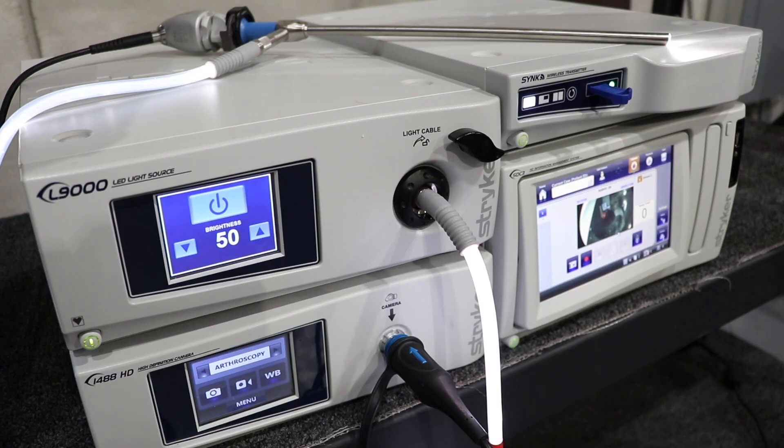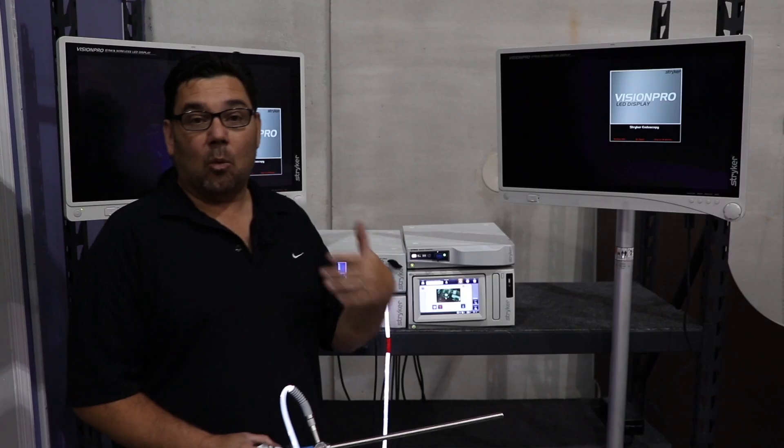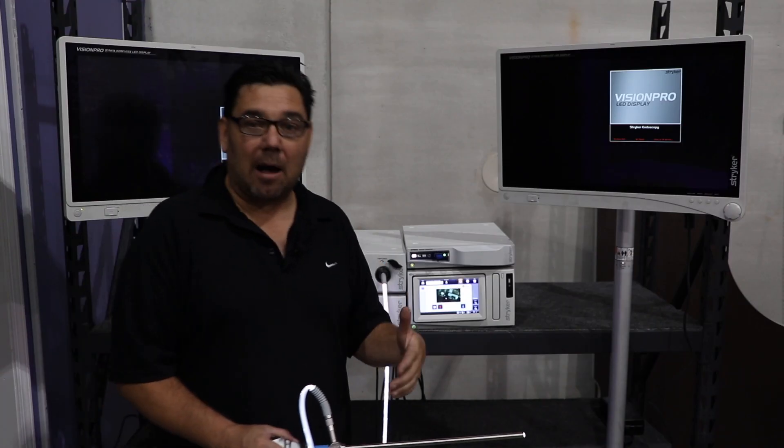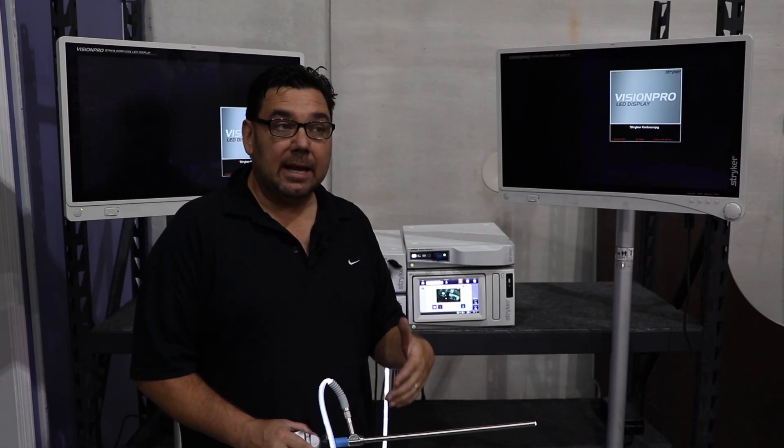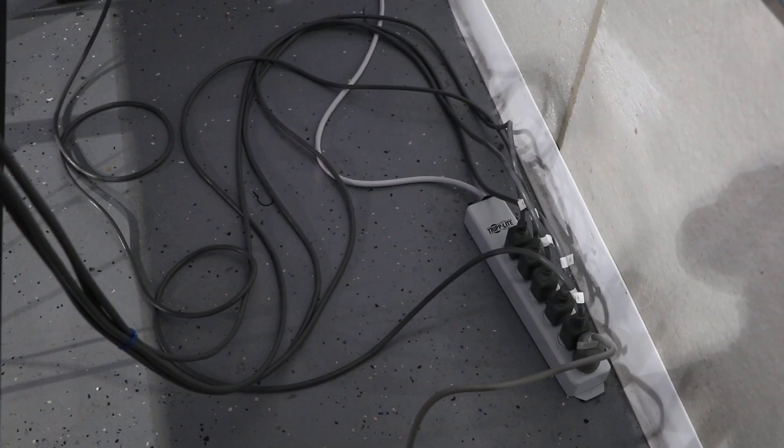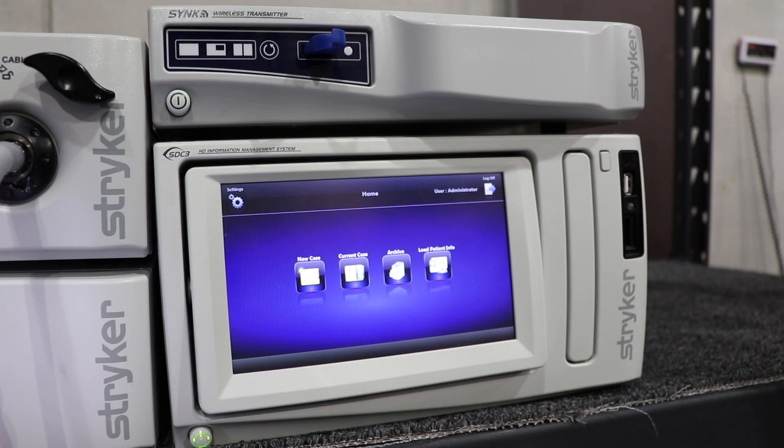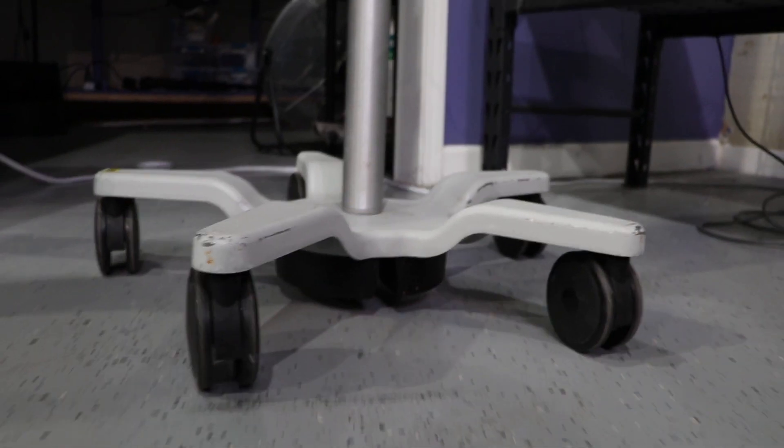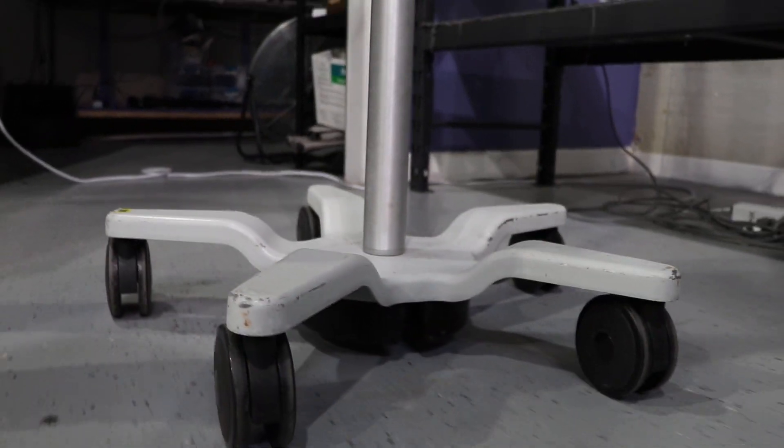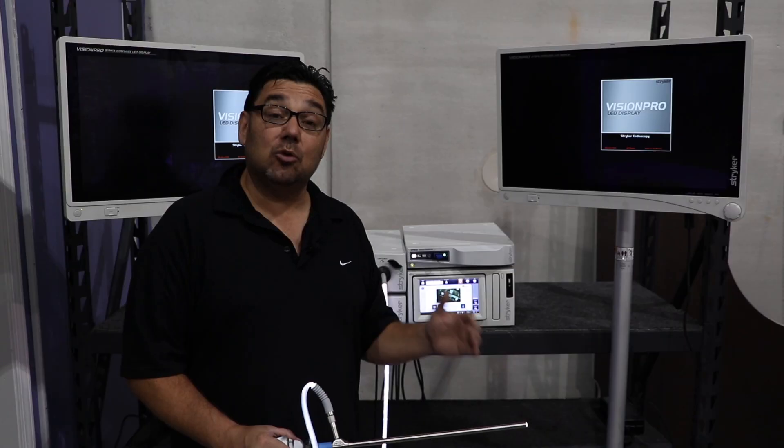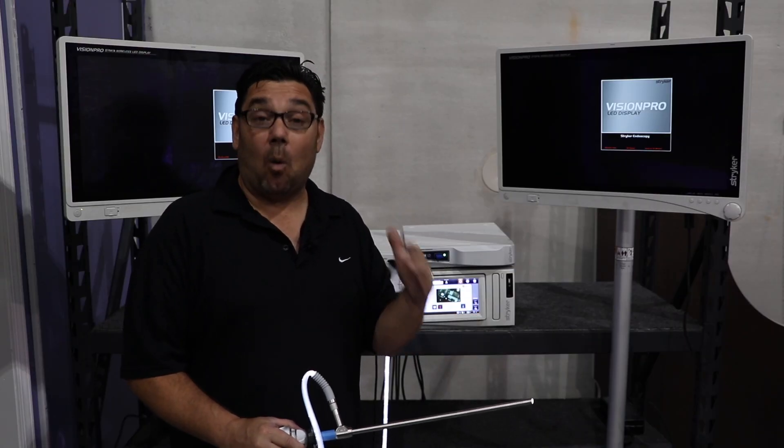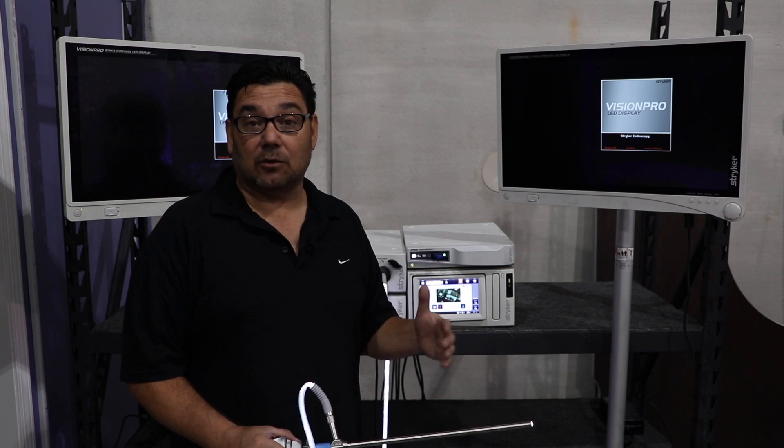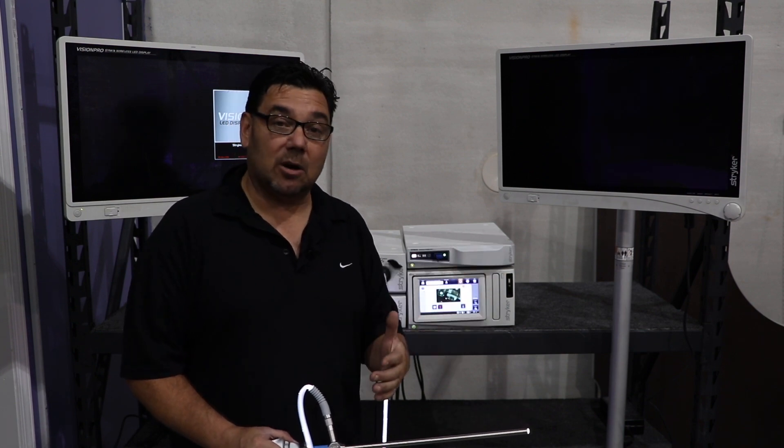Today we're going to explain the capabilities of wireless signal transmission to monitors. One of the main problems in the operating room suite is cords being laid on the floor. With wireless technology, you eliminate the cords coming from the video cart to the monitor or vice versa.